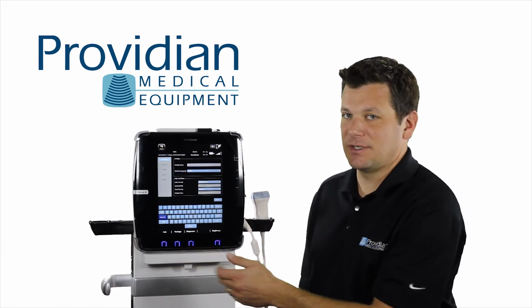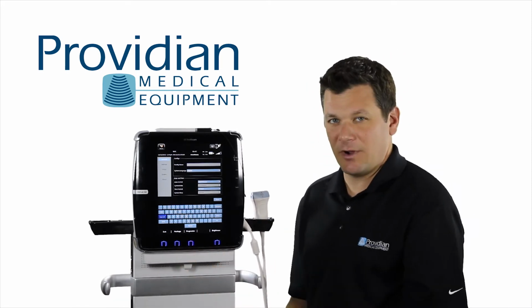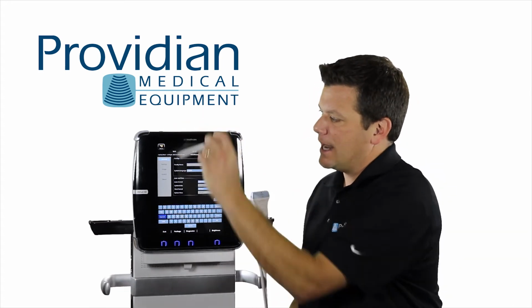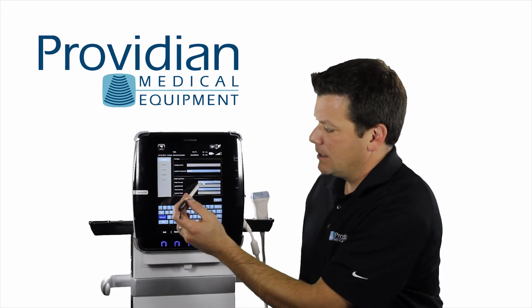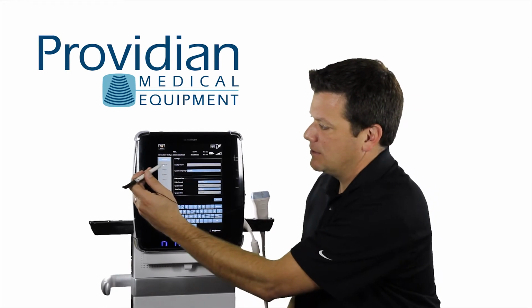You have your diagnostics, which is for your service engineer, so it's not something you're going to be doing. Package, we've already seen package. That's going to set the overall package for your system. And now we have our settings. You can enter your facility name, system, language, the date format, the system time, the time format. You can set all of these.